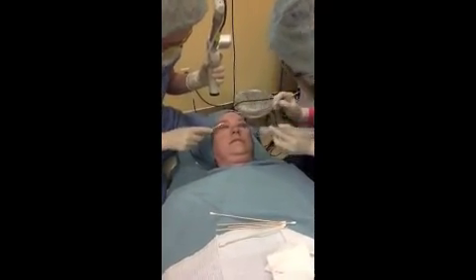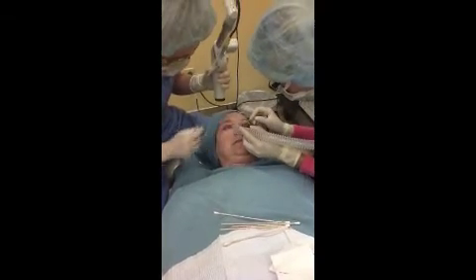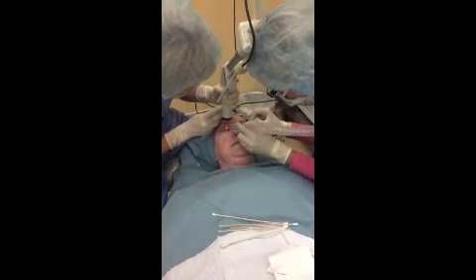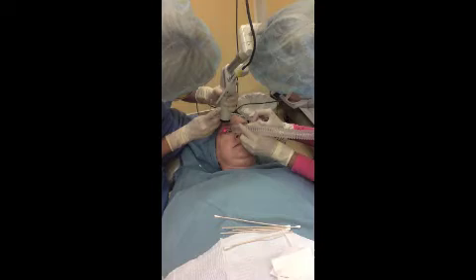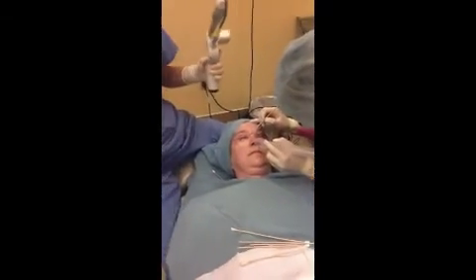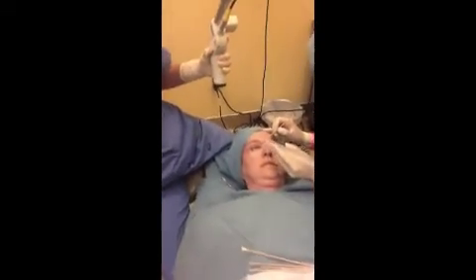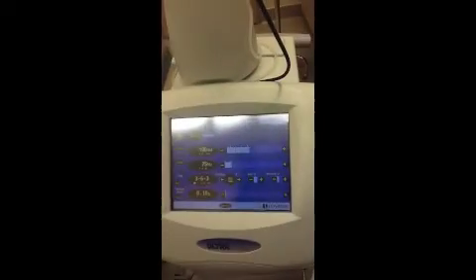Where are we going? Up here. I'm going to go on to my toes. We need kind of a close-up of that. Why don't we come in closer? Keep your baby a second, sorry, I bumped your neck. You can just bring it around. There we go. We should show this — show the luminous. Alter pulse. Beautiful.